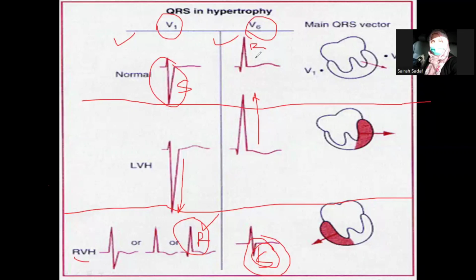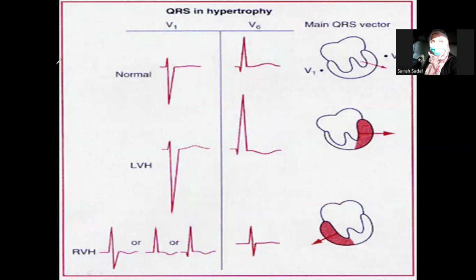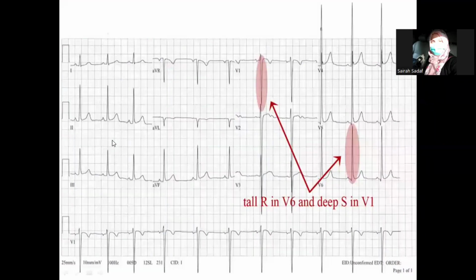Okay, everyone's saying got it. Okay, good. So that was all about the hypertrophy of the heart. Now you will identify which hypertrophy this is. Now come on, I have another exercise for you all.